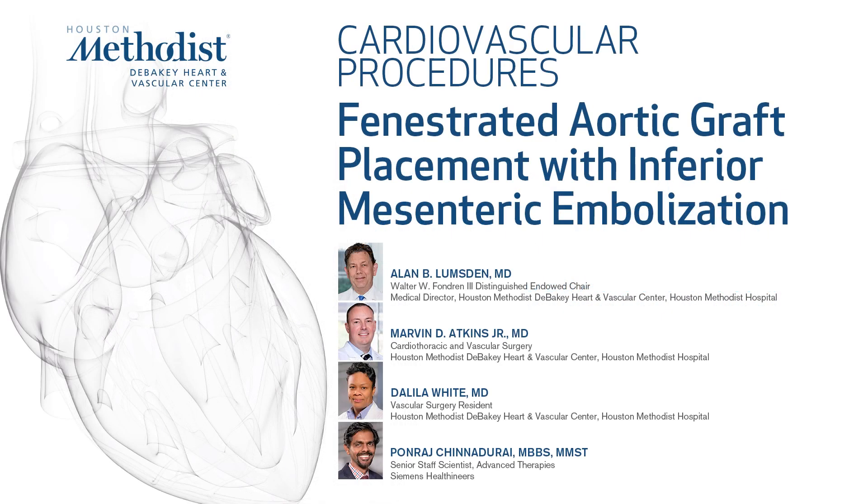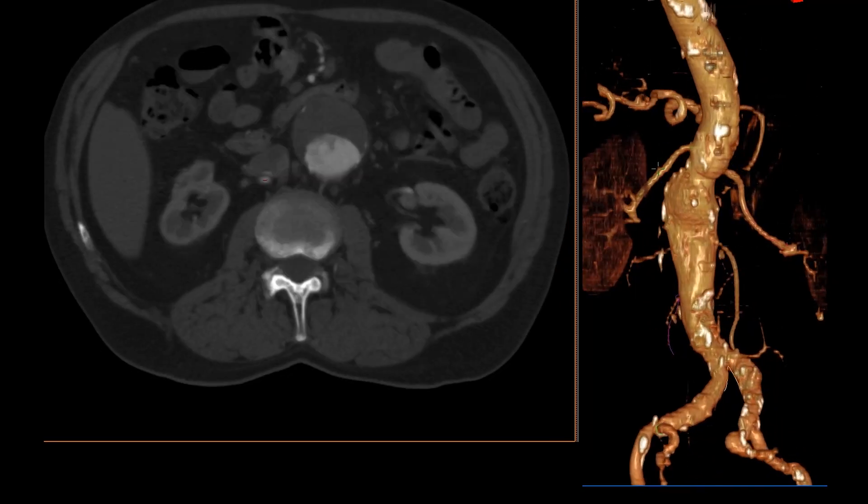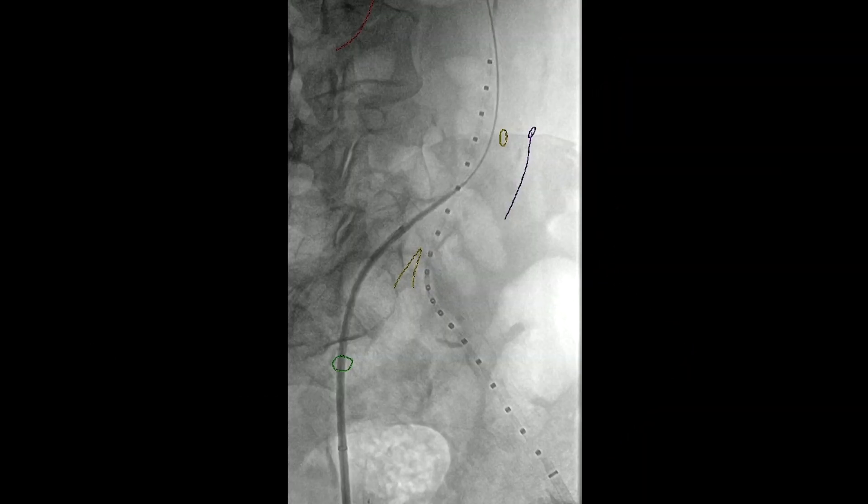This is a 68-year-old man with a juxtarenal abdominal aortic aneurysm. You can see the axial cuts on the left and the surface render images on the right. There is a patent IMA which is coming out of the aneurysm.